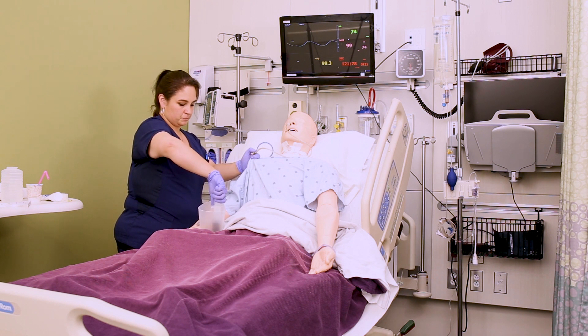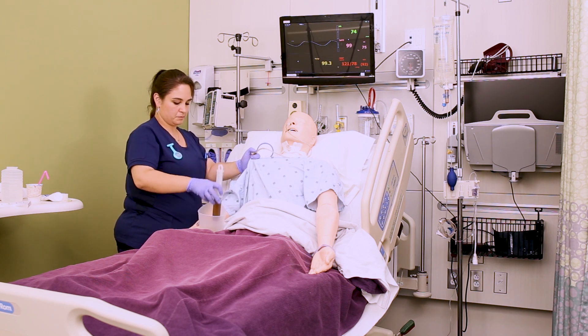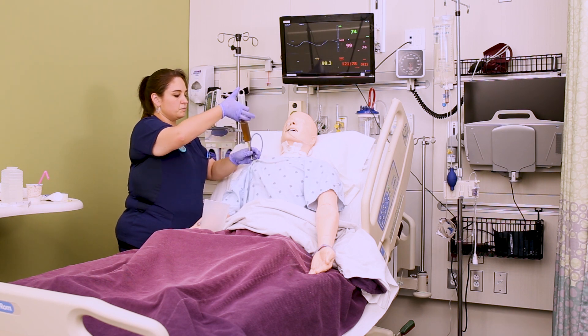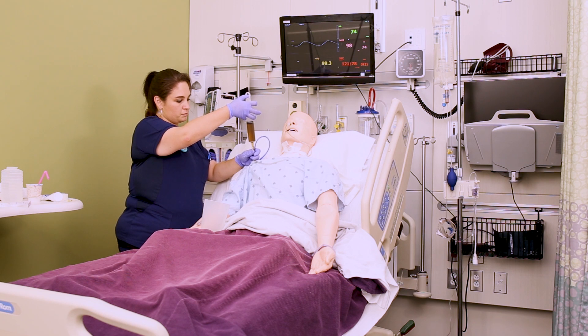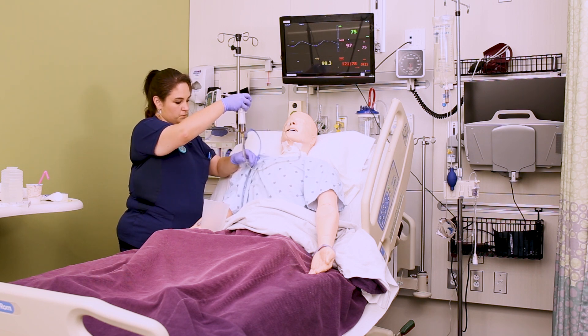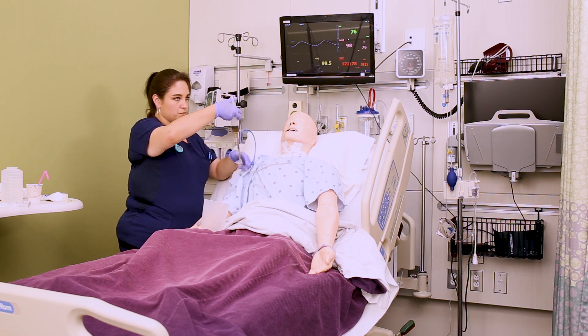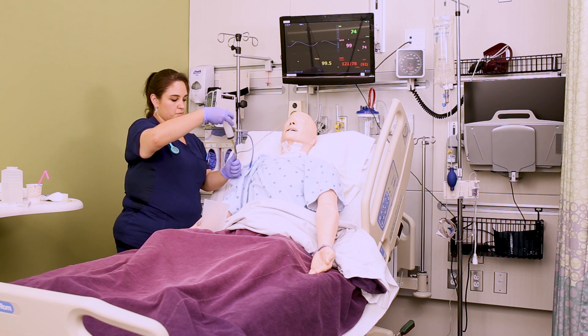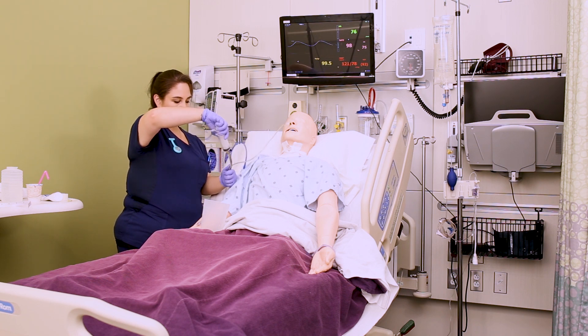Make sure you know your facility's policy here — some facilities will tell you to check every four hours and that if it's over 200 you shouldn't be returning contents, so be an advocate for your patient based on the evidence, but know your facility's policy. Once you have the total, return those gastric contents to the patient, flushing gently and easily. As you look at the gastric residual volumes, also note the color and character — a brownish-green translucent appearance is normal for stomach contents.